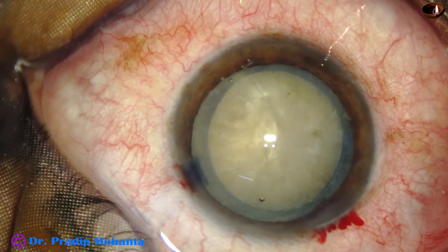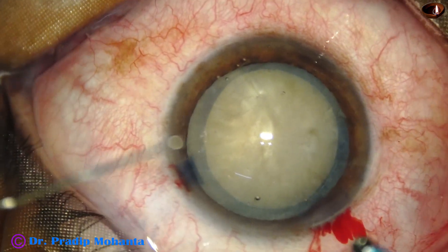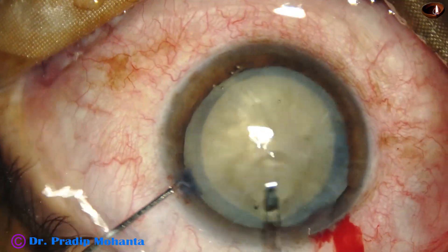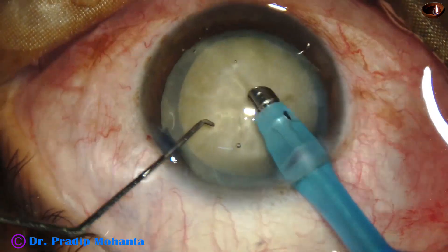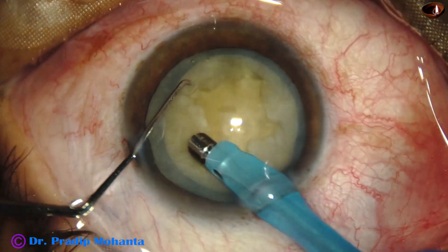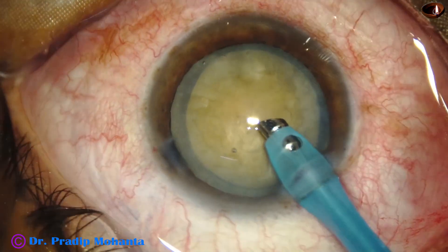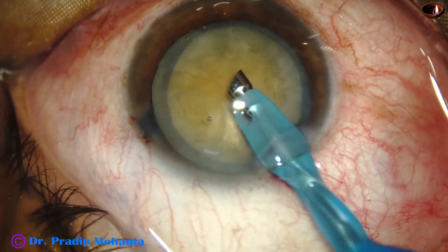Let us observe the submarine chop technique in this case. Submarine chop means the tip of the phaco needle will go inside the nucleus and it will go through the nucleus towards the opposite equator. Some superficial cortical lens matter is removed and the handpiece is rotated.